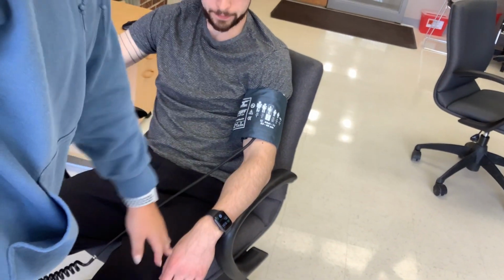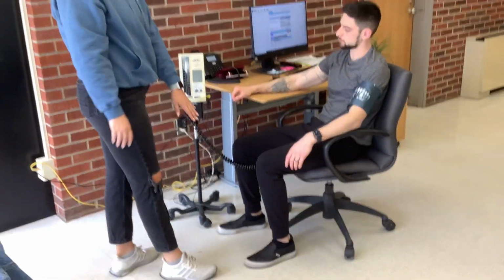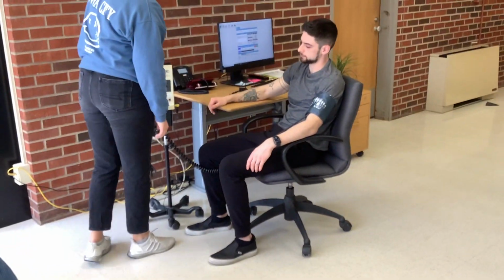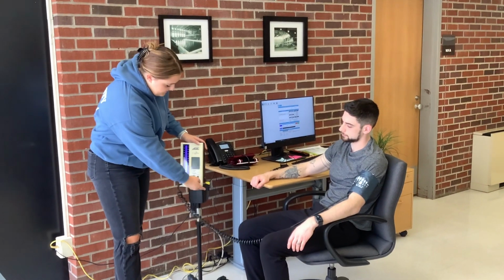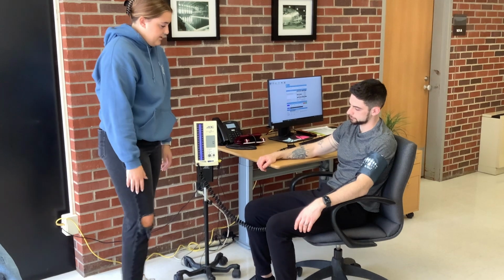And then this cord should just fall nicely there. You want to make sure that their arm is relaxed as well. It doesn't matter which way it's pointed. Then you want to make sure that their feet aren't crossed as well. You just turn it on with the switch there, and then you're going to go ahead and hit start to get this reading started.